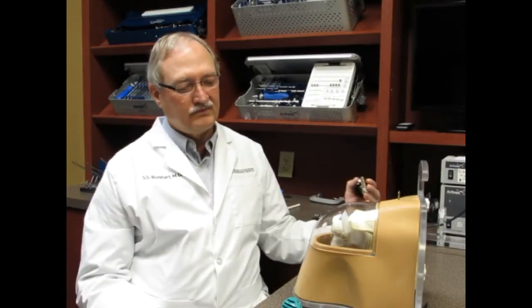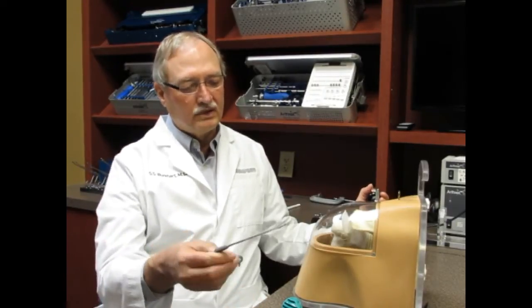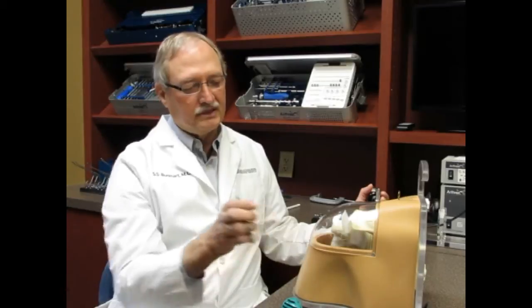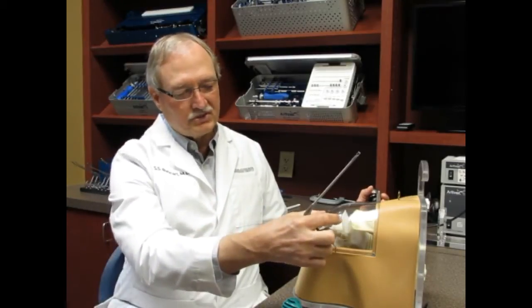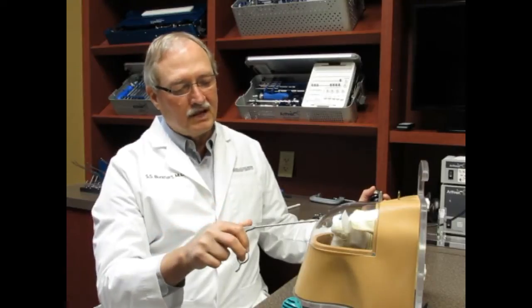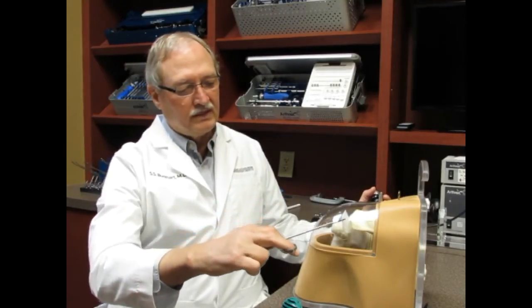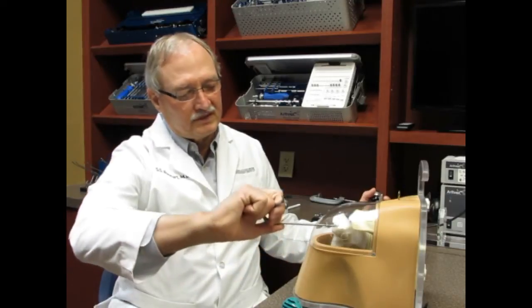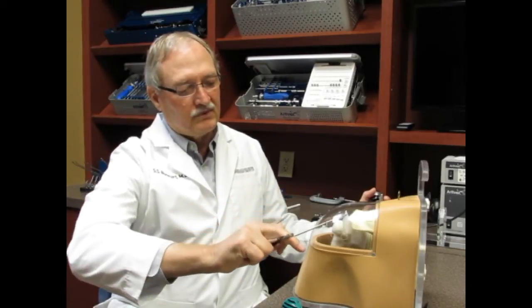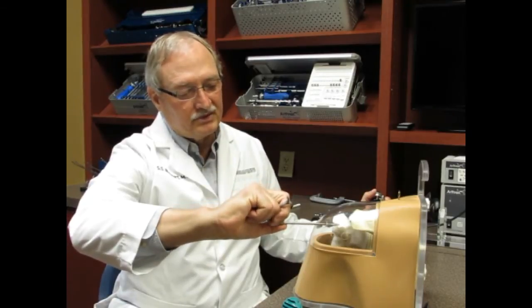What used to happen if you had a torn rotator cuff, for example, the only way to repair that was with a big incision in the shoulder, and you would have to open the shoulder up and be able to see these structures. This is a model with a plexiglass window so you can see what's inside the shoulder, and this would be a torn rotator cuff that is pulled loose from the bone. If you were to repair that, you'd want to pull it down to the bone and have a way to repair it back to the bone.